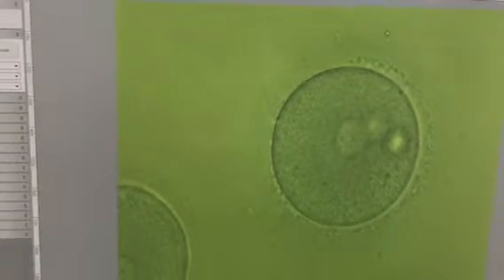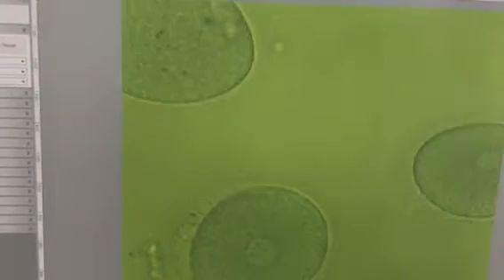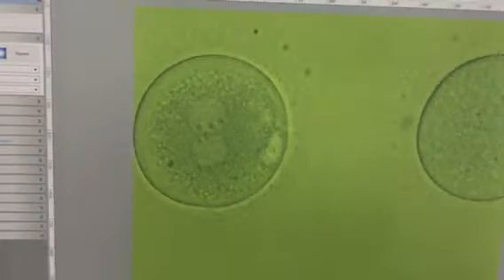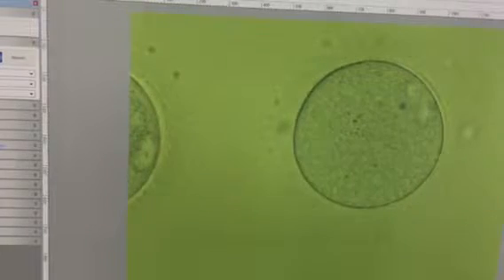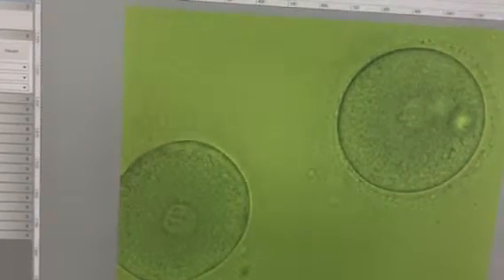The ICSI went very, very well, it is like a textbook. What is the date today? It is 14-8-2018, 14th August. Yesterday we did an injection, right? I just want to tell the date so that we can have documentation on record also when we tell the dates.